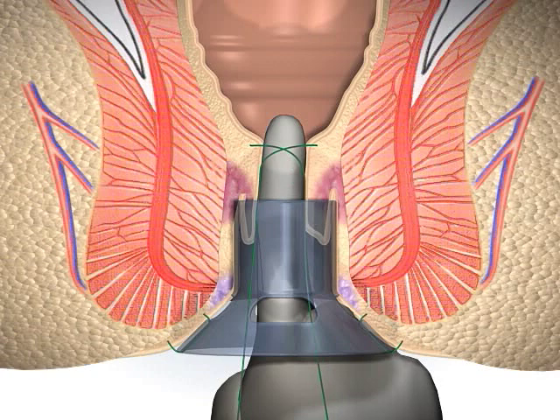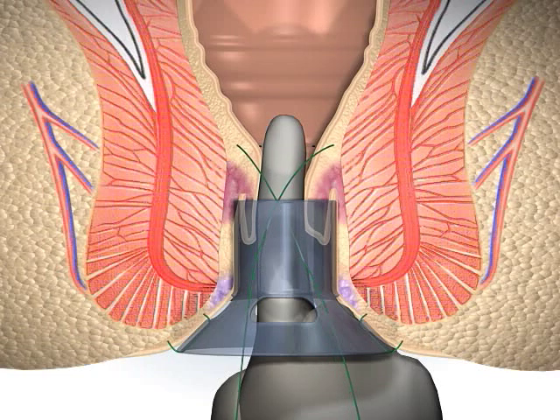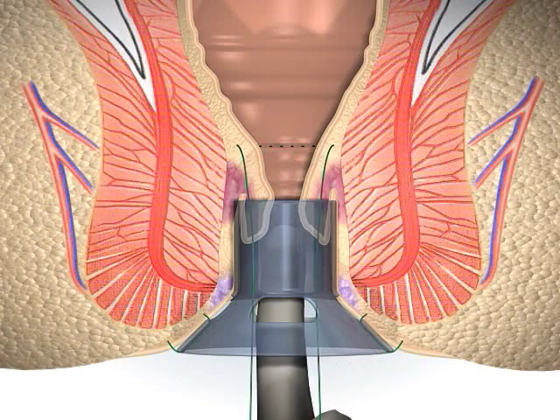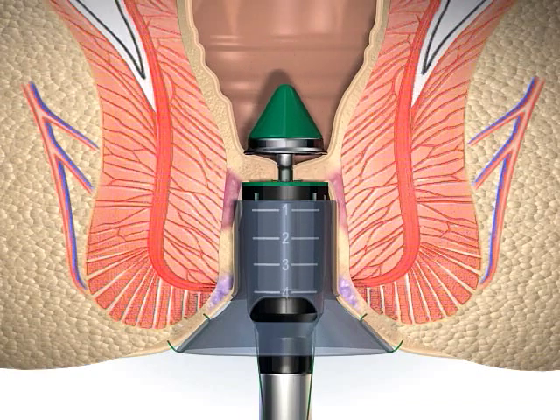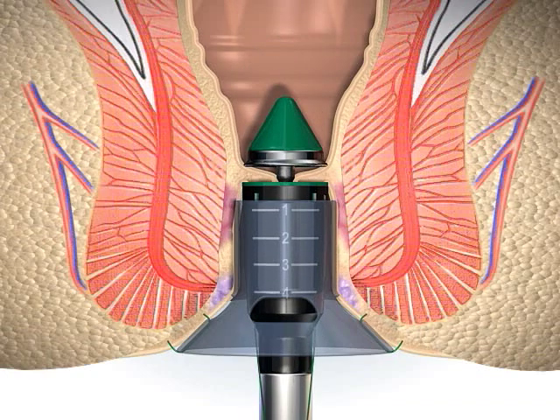The location of the purse string suture must ultimately result in a staple line that resides at least 2 centimeters above, so that the prolapsed mucosa begins to be drawn into the stapler casing.